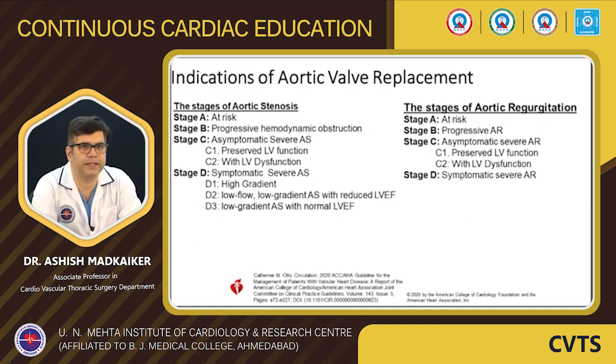Okay, so to begin with, we will see what are the indications for aortic valve replacement. So primarily, aortic valve replacement has two main indications: in a setting of aortic stenosis and in a setting of aortic regurgitation, when the valve has become stenotic and when the valve has started to regurgitate. So these are the main indications for aortic valve replacement.